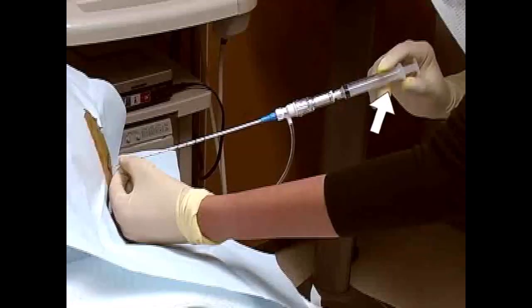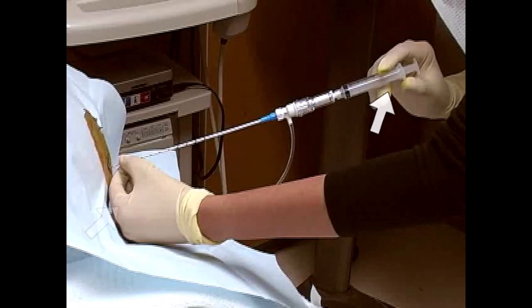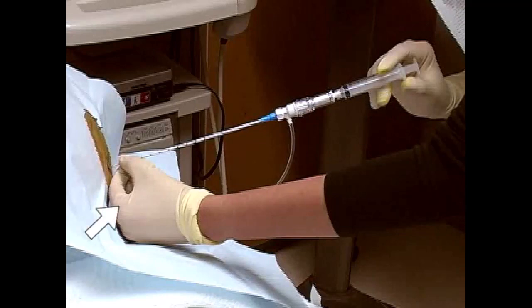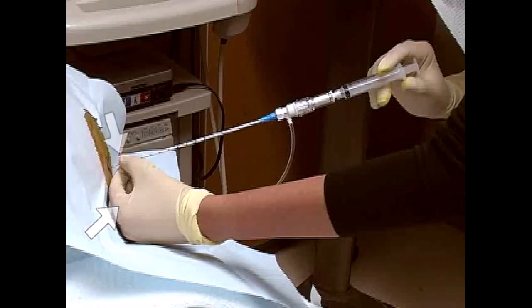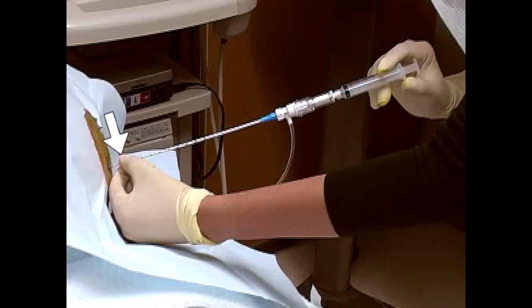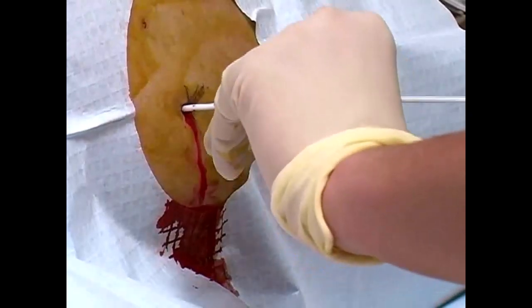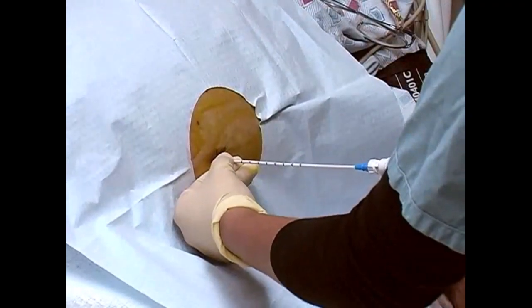Hold the back end of the catheter assembly in your dominant hand. Rest the dorsal surface of your non-dominant hand on the patient's skin and use the thumb and index finger of this hand to steady the shaft of the needle. Insert the needle into the skin nick and carefully advance the catheter assembly.